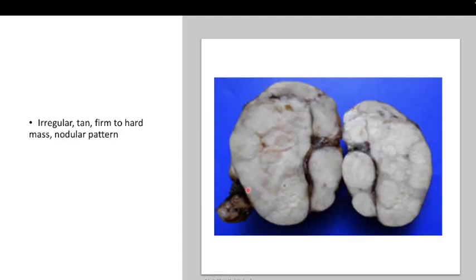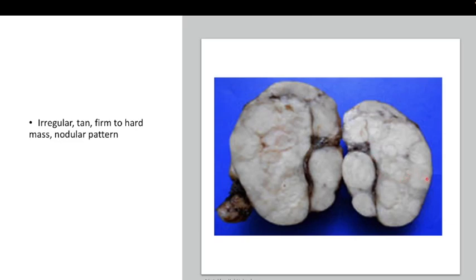We move on to the next case. When you examine this lymph node macroscopically and bisect it, you can see there is an irregular tan firm-to-hard mass replacing all the normal lymphoid architecture. There are quite well-circumscribed tan masses in a nodular pattern, separated by fibrous tissue. In between, there's a whitish component — an area of necrosis. So basically, the lymph node is enlarged with a nodular pattern, firm-to-hard and tan-whitish-grayish in color.